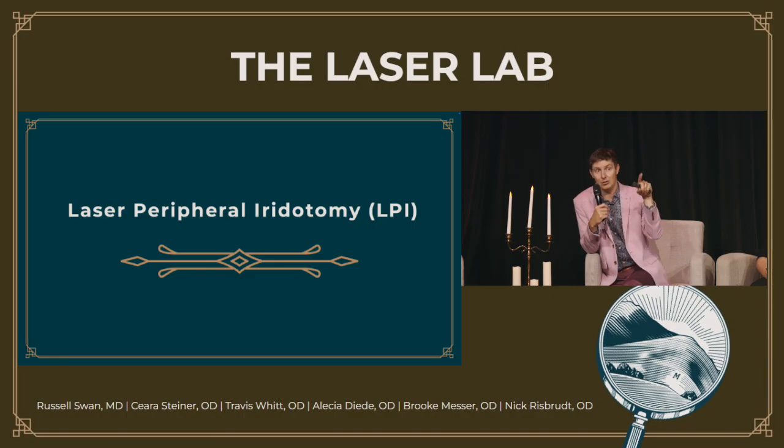And in that setting, you can also still use a YAG laser. We do an anterior offset. You actually don't need a high energy, even though it looks pretty fibrinous. You can drop the laser energy down to 1 or 1.5, and you basically just make small little cruciate openings, usually starting with 4 at the cardinal directions, and then adding 4 more intervening. So you have 8 little spots that break up that contracting membrane and allow the lens to sit in its normal position. It looks rather unusual afterwards if you dilate the patient. Visually, it's outside of their scotopic pupil, so it's not bothersome to them, but it can look a little unusual as you look at it the next time.